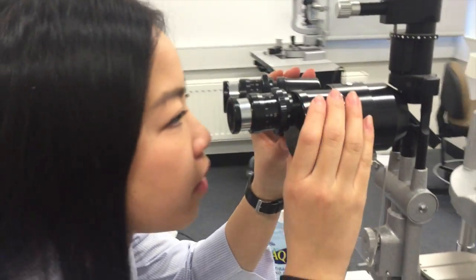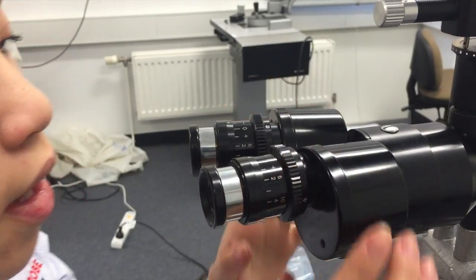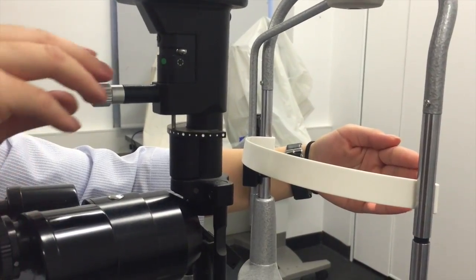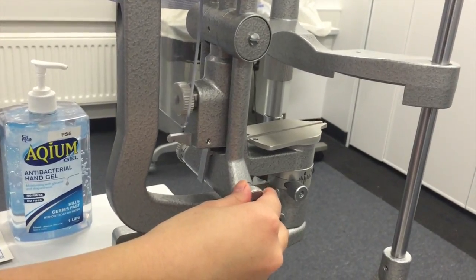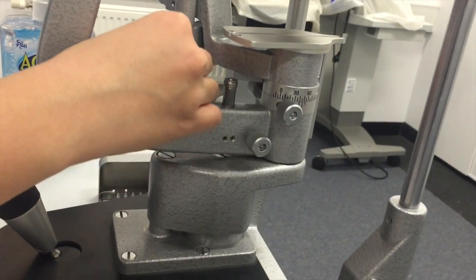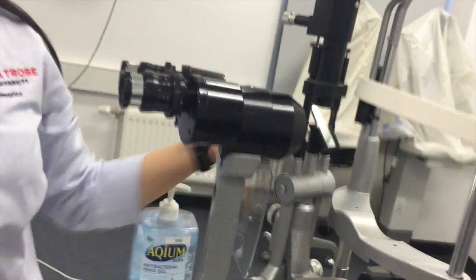Now I'll be setting up the pupil distance and my refractive error — turning here for pupil distance and this for refractive error. We'll also have the magnification at 10 times on the 1.6. We'll change the settings to the white filter, highest illumination, and the narrowest beam. We'll change it to go 60 degrees temporally to the patient's right eye and lock that in.